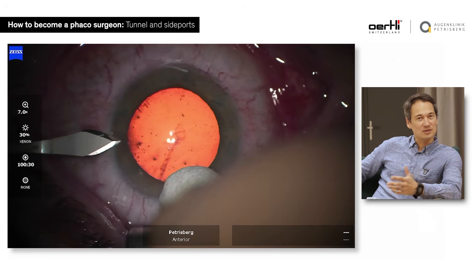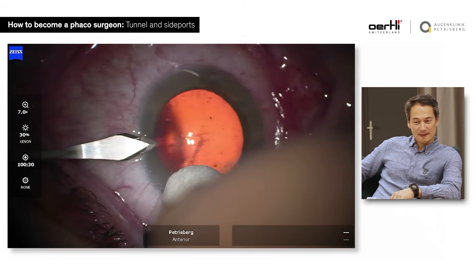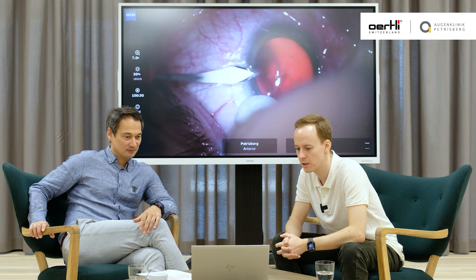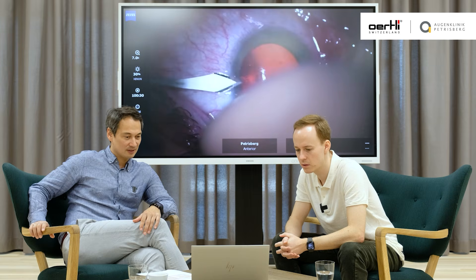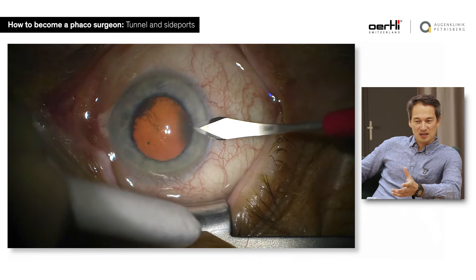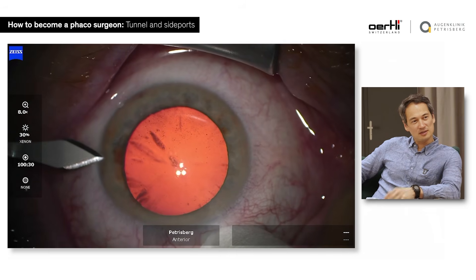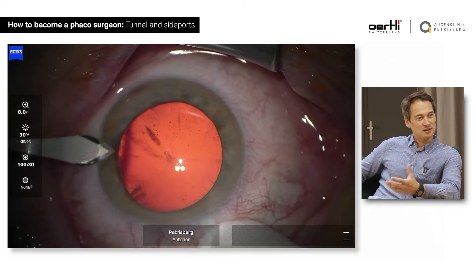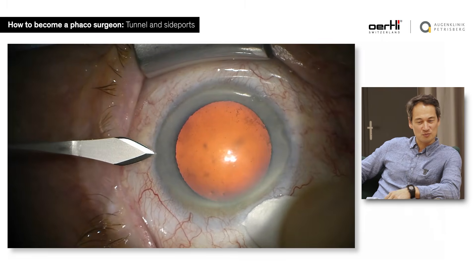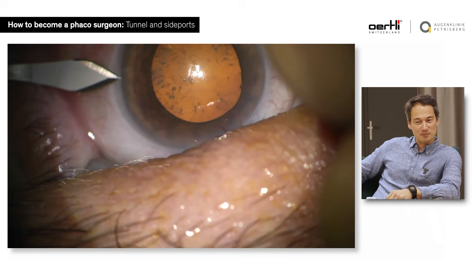What we're looking at now is only the tunnel incisions that Lukas is making. You can see that the eye is moving too much — way too much. This is another important thing: at the beginning, it's quite natural to doubt the main incision and to doubt every step on the way. You can see that in the way you move and handle things, and the shaking is getting better.